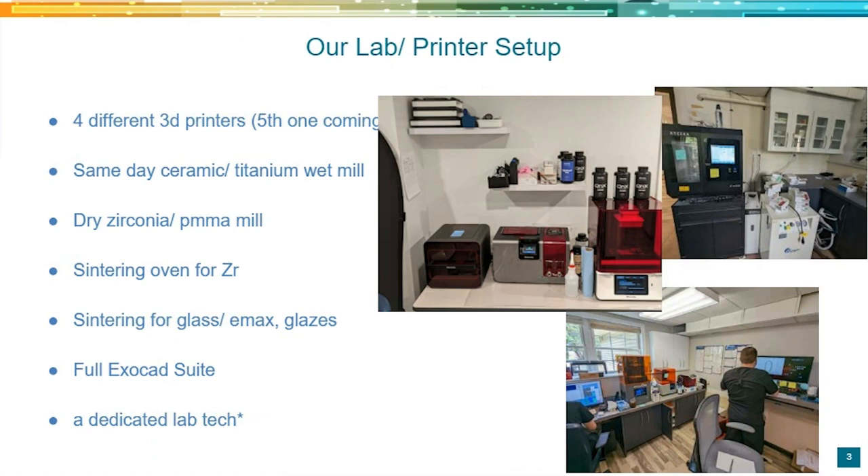These are photos of our in-office lab. We started with just one Form 2 printer about five years ago. That's an SLA type printer — it takes about two to three hours to print a model. With DLP type printers like Sprintray, the printouts are significantly faster, allowing us to deliver same-day 3D printed temporaries. We have four different 3D printers. We have a same-day ceramic and titanium wet mill to make custom abutments, a dry zirconia PMMA mill so we can make our final zirconias, and if we're doing final PMMAs, we're doing those in-house as well.